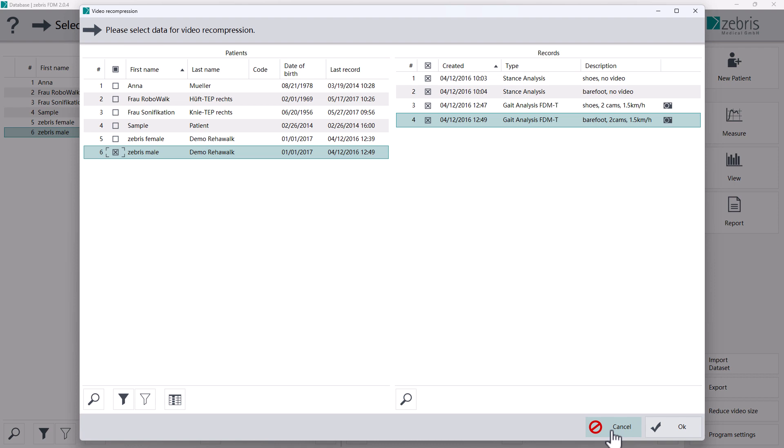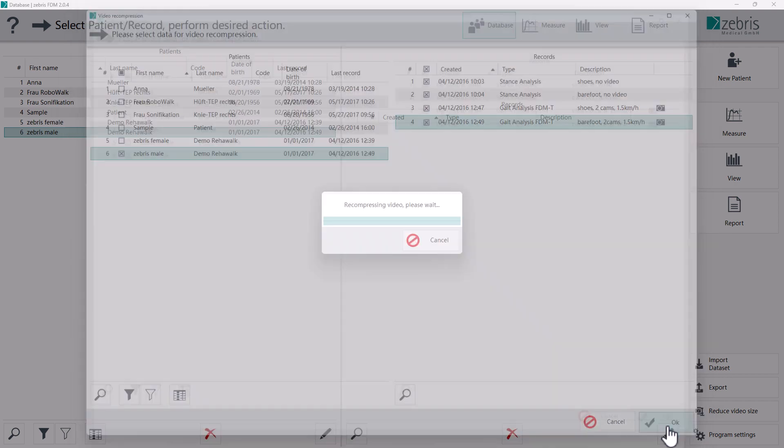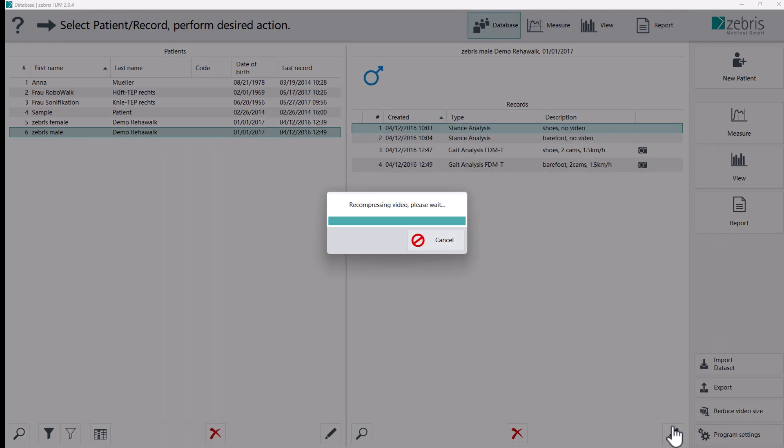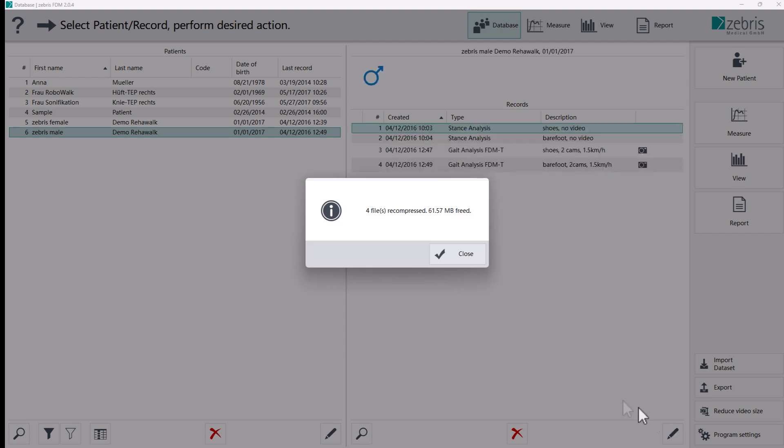Click on the cancel button to cancel the process. Confirm your selection with the OK button and the compression will start. After finishing the compression process, you will be informed how much storage space has been released.